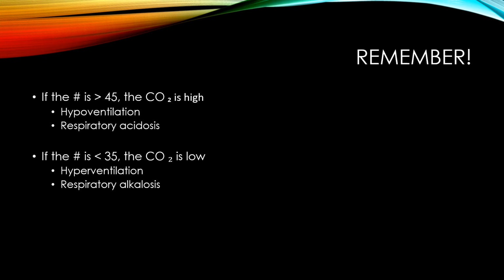If the end tidal CO2 number is less than 35, the CO2 is low. If this happens, your client for some reason has some hyperventilation going on. They are blowing off too much CO2, so your client would be in a respiratory alkalosis.